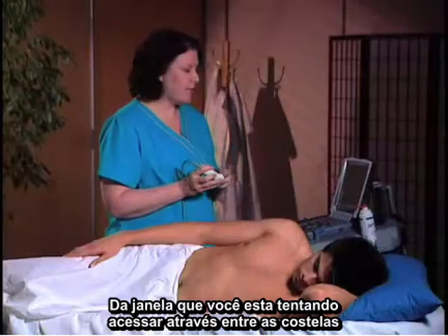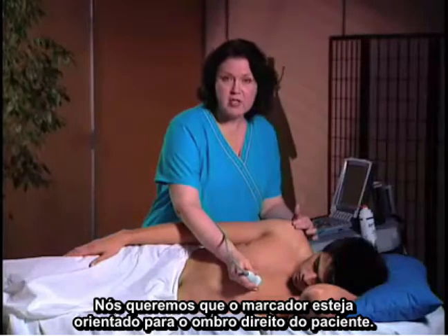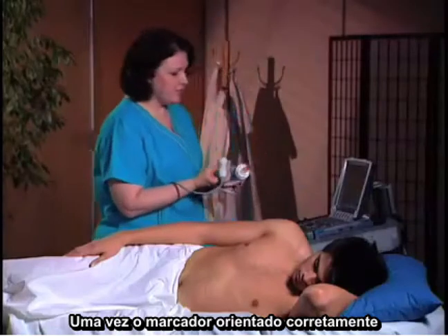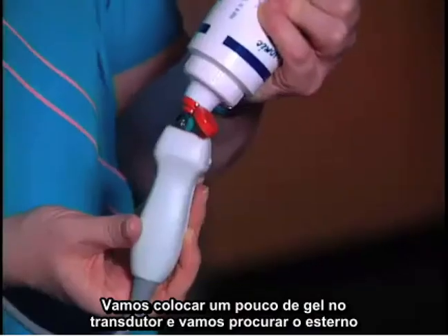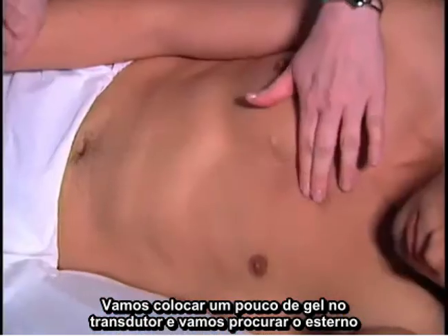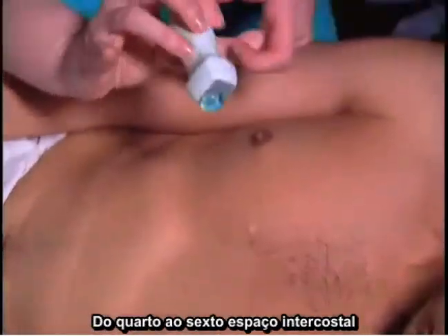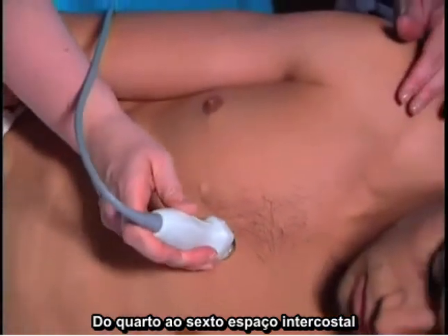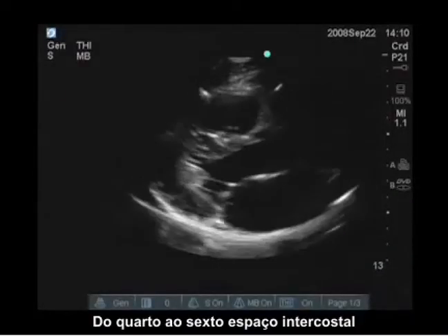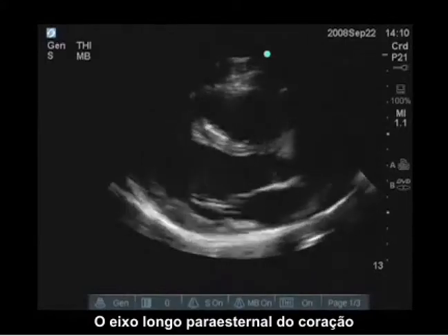When doing a cardiac examination with a cardiac exam type, we want the orientation marker facing up to the patient's right shoulder. Once we have the orientation figured out, we're going to put a little bit of gel on the transducer, find where the sternum is, and just move just a little bit left of the sternum, looking for the fourth to sixth intercostal space. That should put you at least in the ballpark area for where you're going to find the parasternal long axis view of the heart.